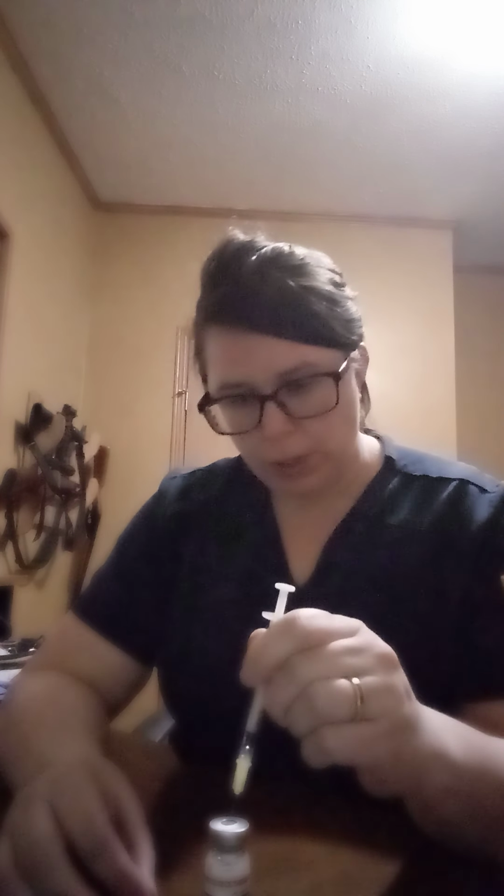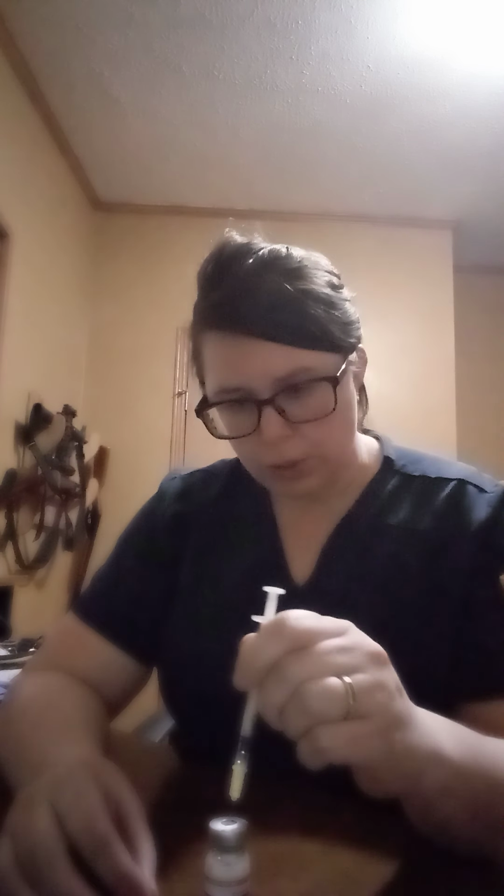For this type of injection, I'm going to use a 1 milliliter syringe, also called a tuberculin syringe, and a 27 gauge needle. The dose that was ordered for this test is 0.1 milliliters. So I am going to withdraw into my syringe 0.1 milliliters of air. Then I'm going to insert the needle into the top of the vial and inject my air. Then I'm going to flip it over to 90 degrees and withdraw 0.1 milliliters of medication. Now if I had any air bubbles in there, I would just stabilize and flick with my finger to get the air bubbles out.